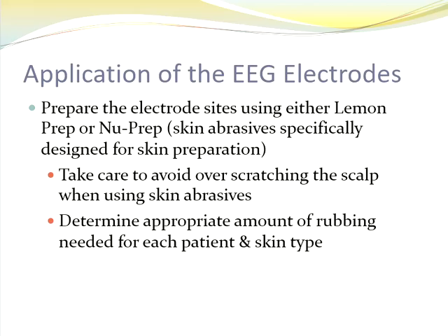So you need to take care not to over-abrade the skin. Don't scrub too hard or too much. We don't want to take the skin off completely. We just want to clean it up a little bit so our electrodes get as good of a contact and conduction as possible. As you continue to practice, you'll figure out how much pressure and prepping of the area needs to be done in order to get a good signal.